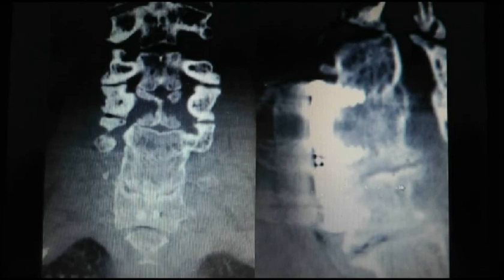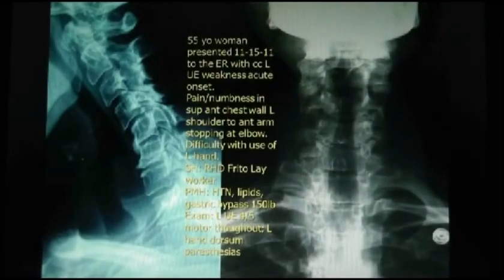So these patients can present with stenosis and radiculopathy type symptoms from this hypertrophic non-union material when they get cervical non-unions. And this, Adam, is the MRI scan. So this is the C5 screw, this is a C6 screw, this is a C7 screw. And there's a black line above that C7 screw, yeah. Yep. Did you find that kind of interesting? So you could have made this diagnosis on the MRI, but it would have been very difficult.